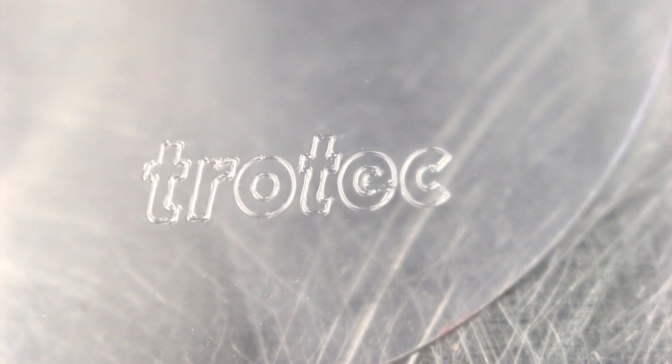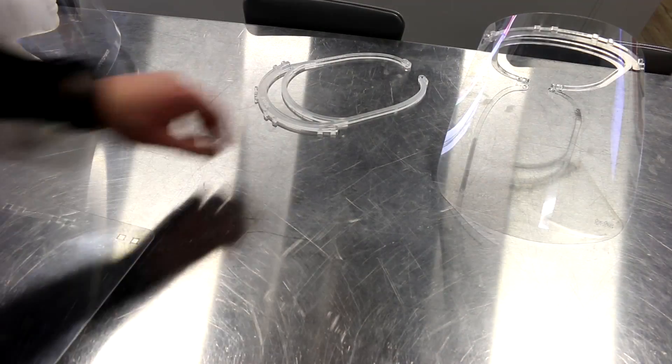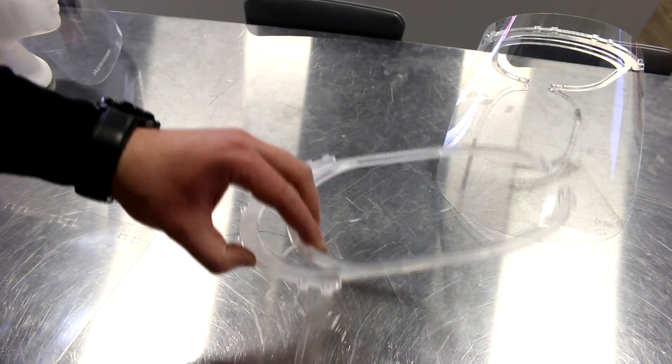Kiss-cut means we've used minimal power to just mark the plastic — we never cut through it. We then assemble the two pieces together.